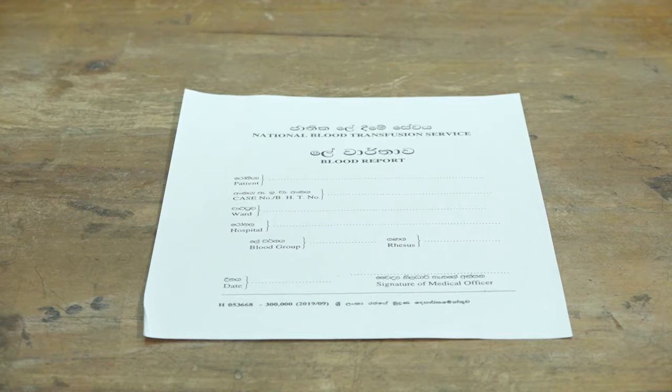So, you fill in a normal request form and send it with a plain tube of 2 cc of blood, and you will receive the blood report on a form such as this.